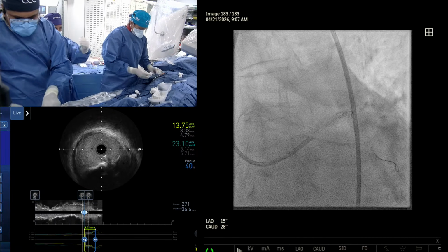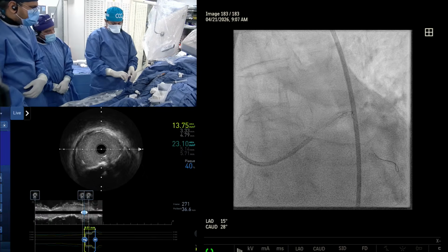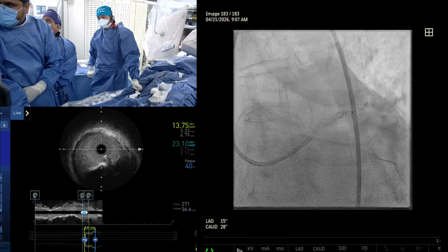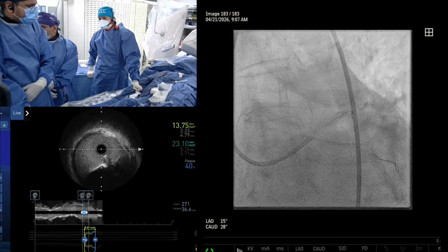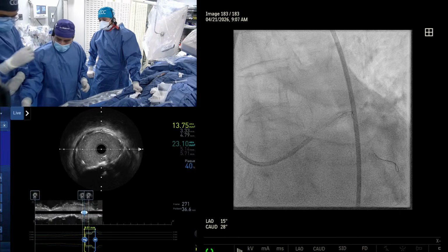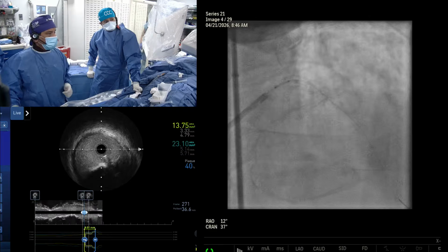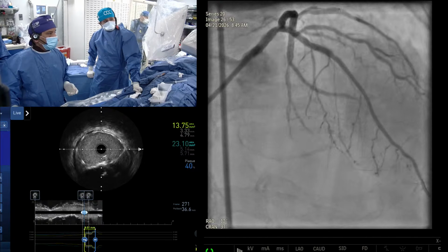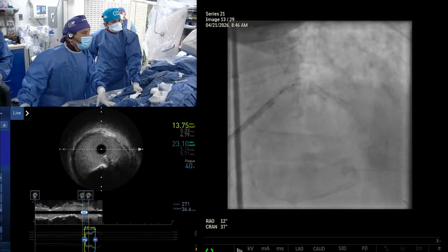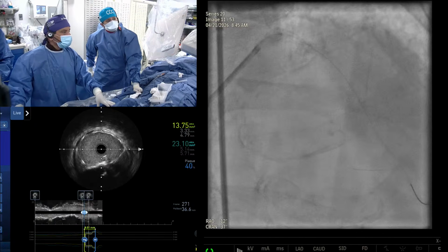So right now, your stent really has to go to that adventitial level because of the deep medial dissection. Good. Now try to understand where the 4.5 balloon was. Let's see, maybe we can look into that. I think I have a cine right here. If you don't do that, then the proximal edge is not covered.